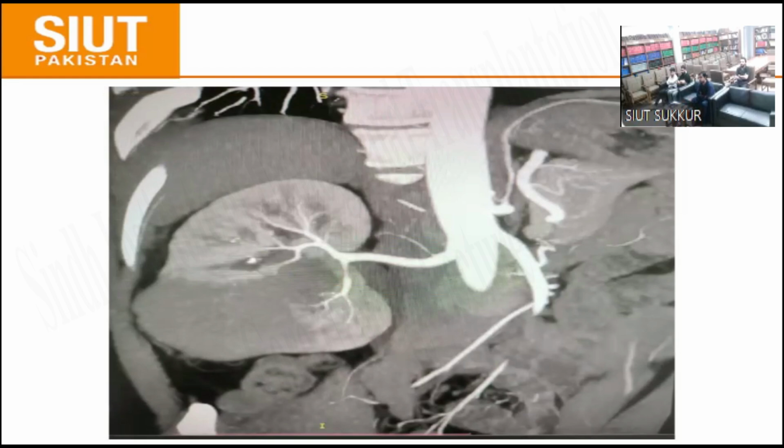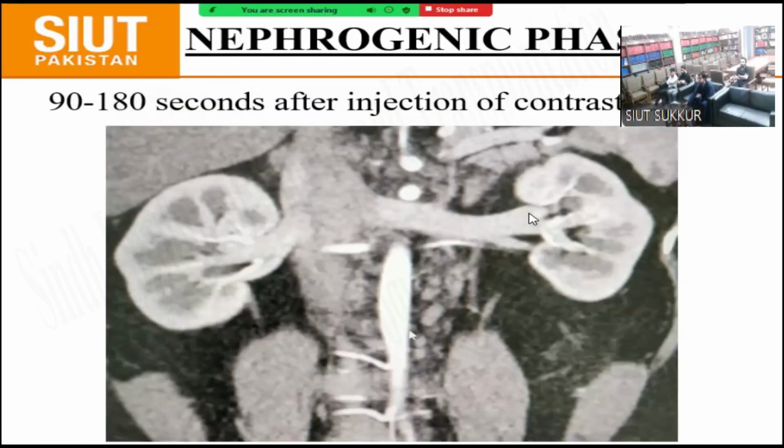So from this image alone, one can suspect renal injury. Any other finding? What can it be? Hmm? You're right, renal mass. So we need more cuts or more sections to comment further.